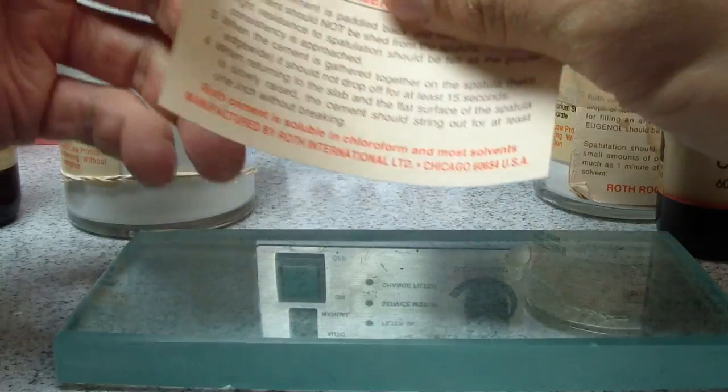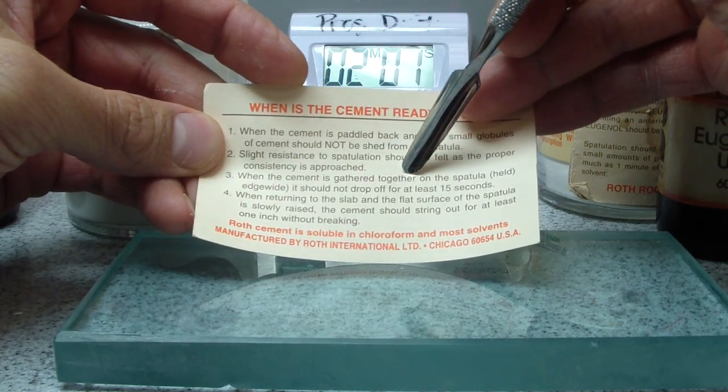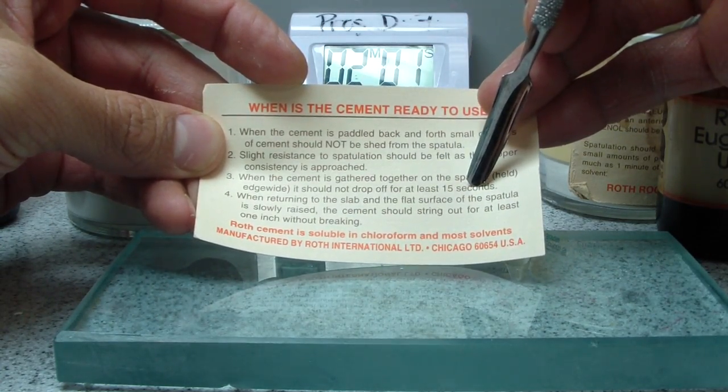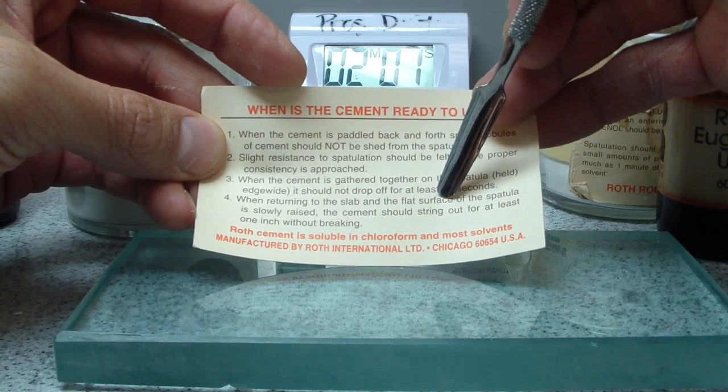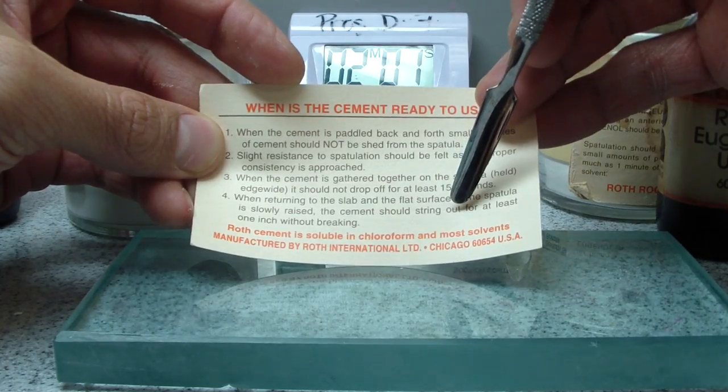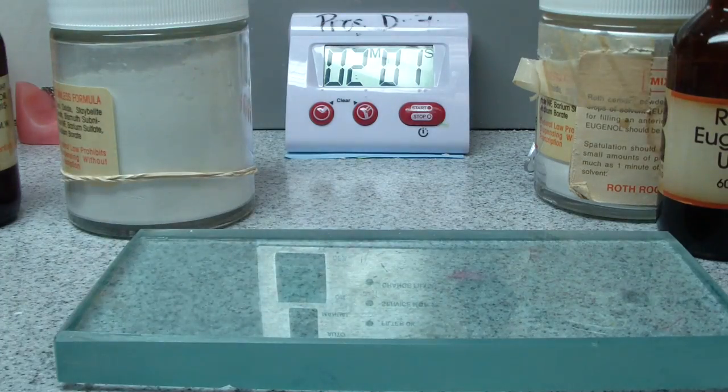And then on the back—so I'll take a picture and put this up. Paddle back and forth. When the cement is gathered together on the spatula held edgewise, it should not drop off for at least 15 seconds. When returning to the slab and the flat surface, the spatula slowly raised, the cement should string out for at least one inch without breaking. So 15 seconds and one inch. I mean, I remember I learned that in dental school 13 years ago.